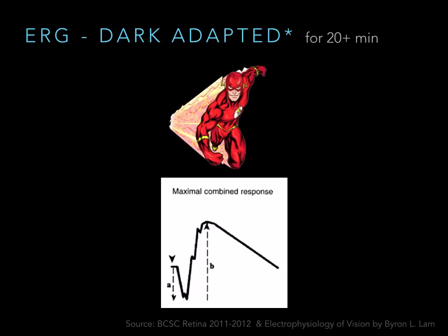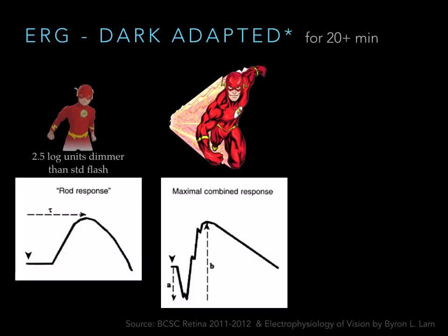Not the zenith, but the nadir. I don't know, the trough. We'll call it the trough. And then the B wave isn't measured from where you started out at your baseline. It's from the bottom of the A wave to the top. Okay, so let's see if I'm missing anything else I want to tell you about that. Okay, the next slide is the next little build.